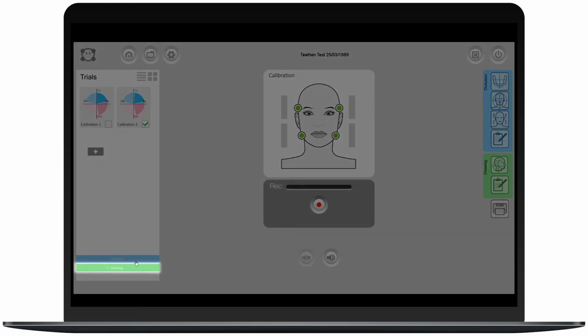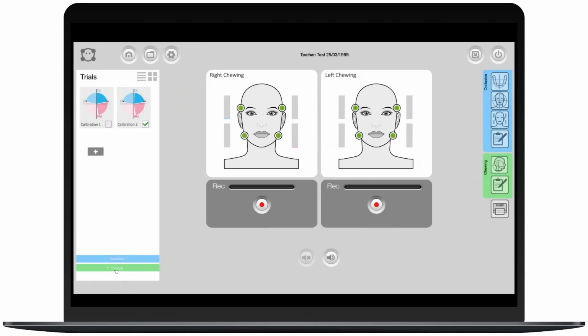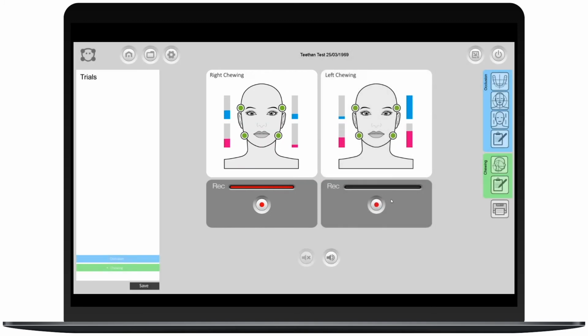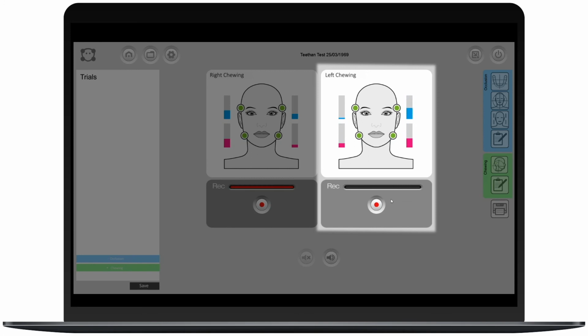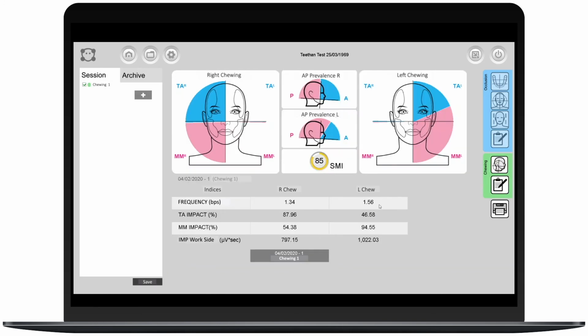To activate the chewing test, click on the green chewing button in the bottom left-hand corner of the screen to show a right chewing and left chewing display. We then ask the patient to chew some chewing gum until it is soft. Then, we ask them to chew only on the right side and record for 15 seconds by clicking the red record button. We then repeat this on the left side for 15 seconds. After the recordings have been completed, the report will be automatically displayed.